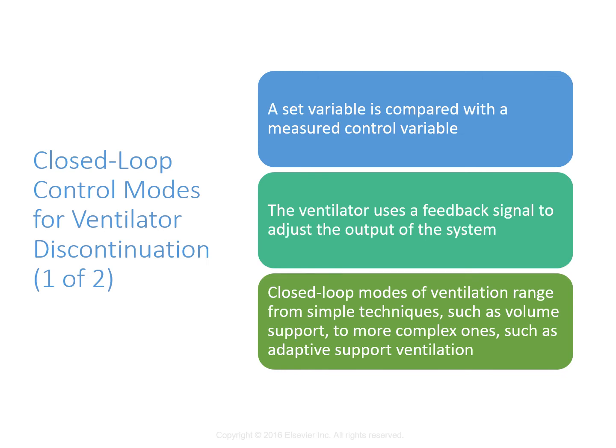Even automatic tube compensation, which helps to reduce the resistance of breathing. Volume targeted pressure support, or volume support if you will. It's the same thing as what I just said. So volume support ventilation, mandatory minute ventilation, adaptive support ventilation, artificial intelligence modes like ASV, right? Those modes can really be helpful also as another method to get these patients off.